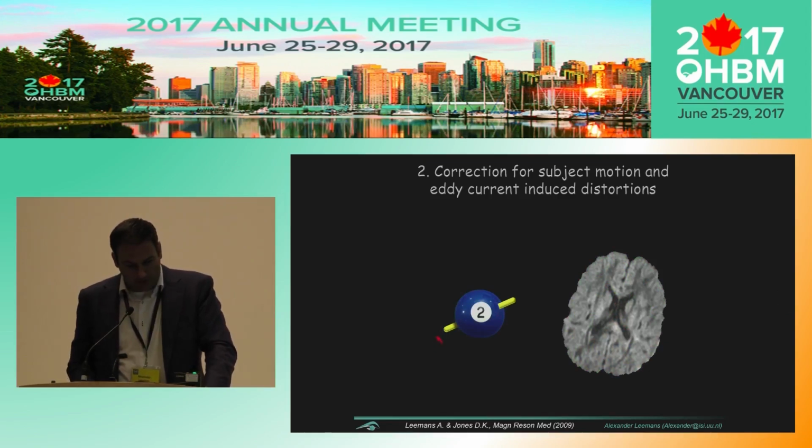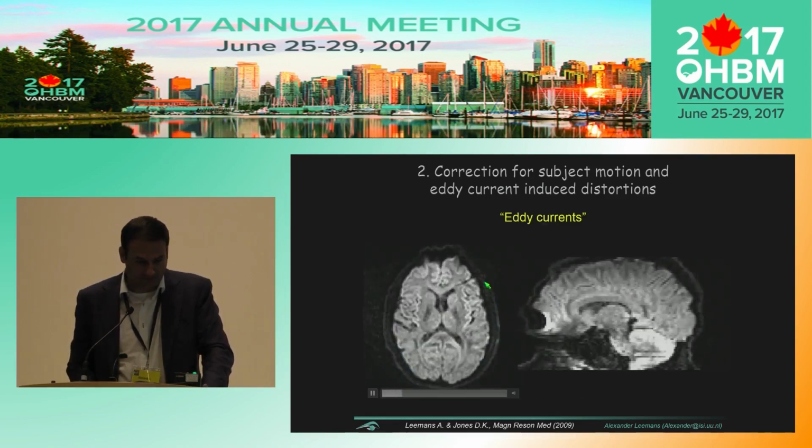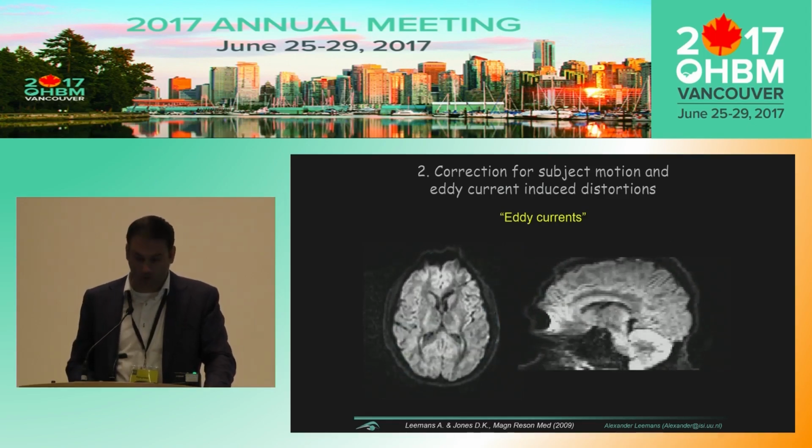So the blue ball over here, what you need to do is basically, if you reorient over here, just reorient the gradient orientations. Okay, it's that simple. And simultaneously, we tend to correct for eddy currents.